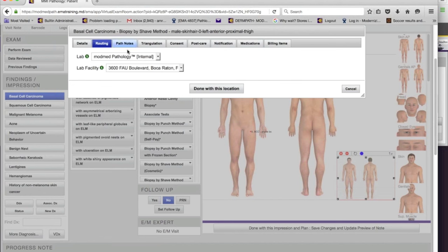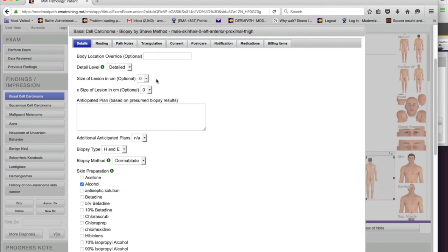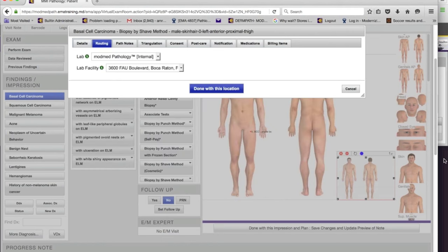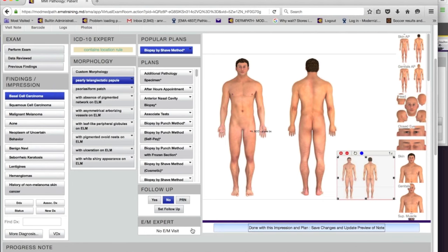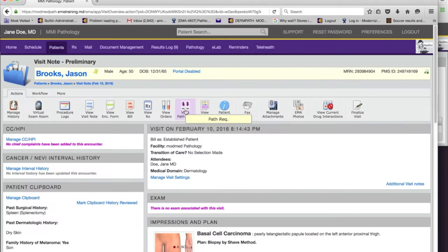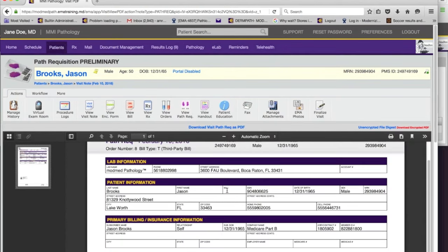The internal lab is already defined here, which is part of the workflow. When you use the pathology module, you route your orders to the internal lab. In this case I've created a lab called ModMed Pathology Internal — it's an internal lab with a lab facility. I'll say done with this location, then save the note. And we have our path requisition created. Here it is — it's going to an internal lab, with patient information and the body location we created.